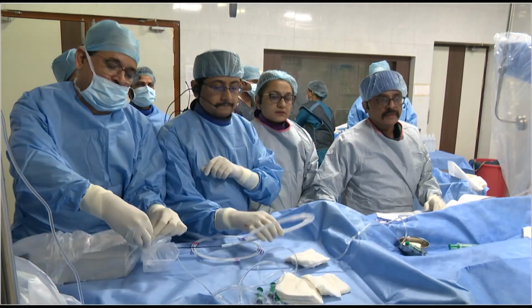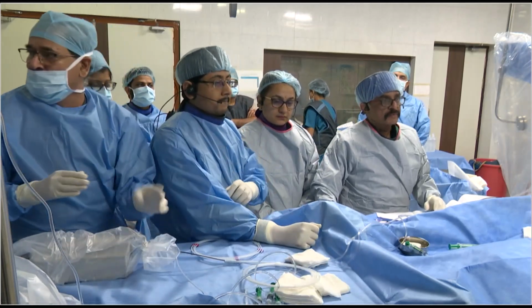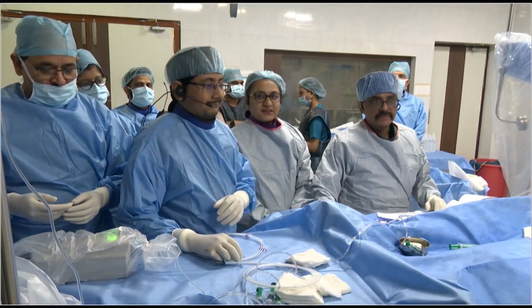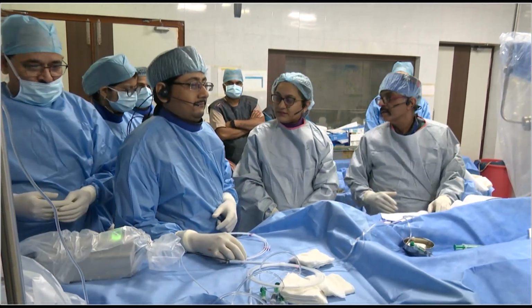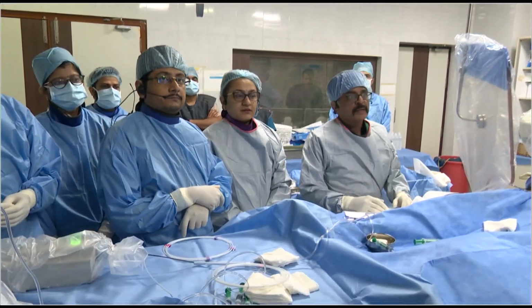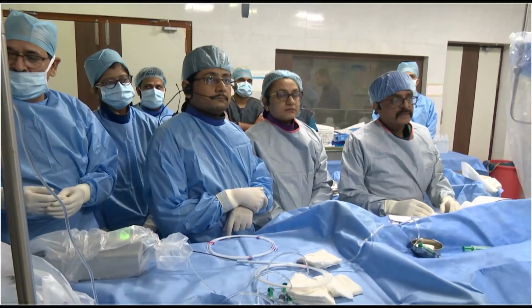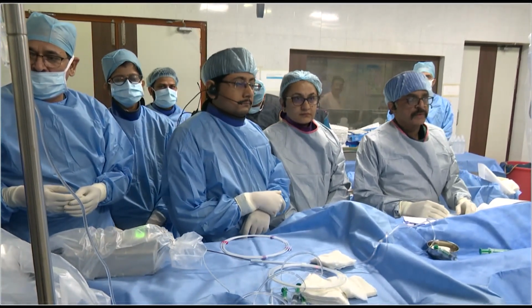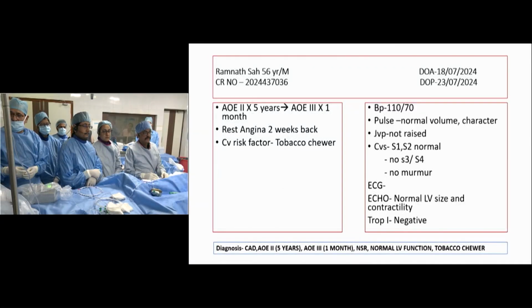I am Dr. Aditya Kapoor. I have with me two of our very accomplished interventional cardiologists, Dr. Roopali and Dr. Ankit Sahu, and we have Dr. Arpita here, Mr. Shiv Dayal, Mr. DK, and Ashwini from the Abbott team. So I'll just hand over to Dr. Ankit to quickly go through the history, and Dr. Rupali will discuss the angio shots which have been taken already.